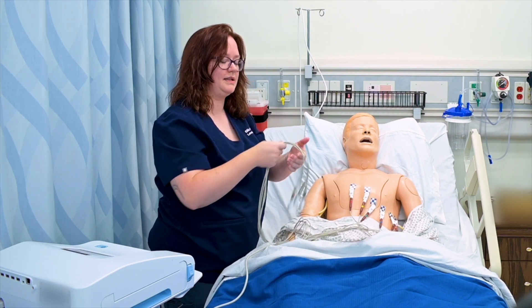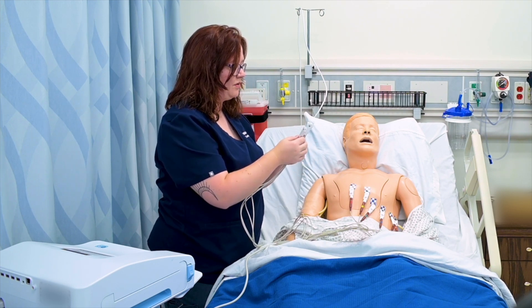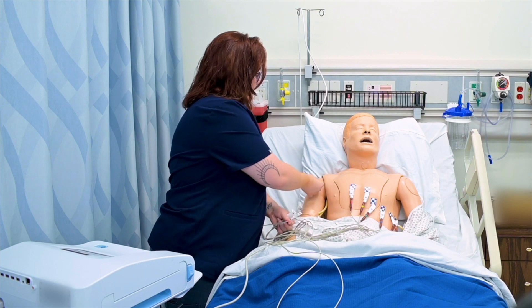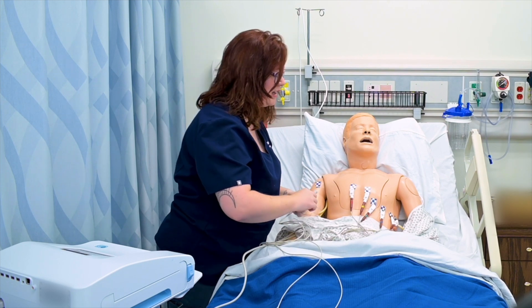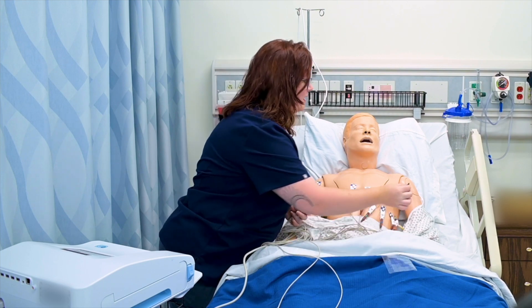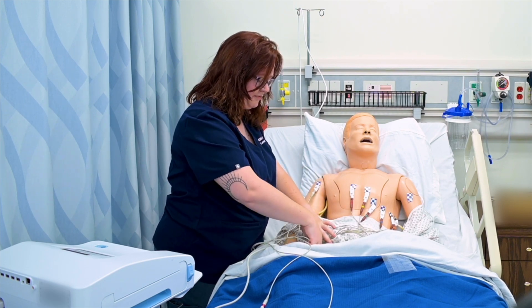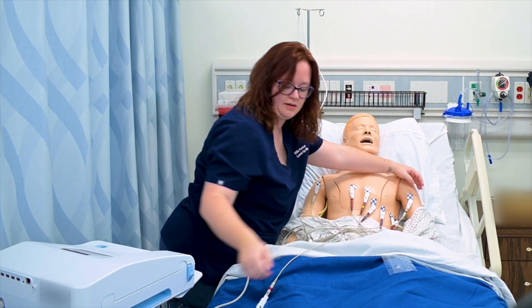The last part is to get my right and left arm and leg electrodes on. I'll get my right arm and leg out — remember, I'm doing the patient's right arm and leg. I'll place a tab for the arm and the leg. The leg electrode doesn't technically have to be on the leg, but it does need to be lower than the umbilicus, so you may see people place it on the lower portion of the abdomen. Then I'll do the left arm and left leg.